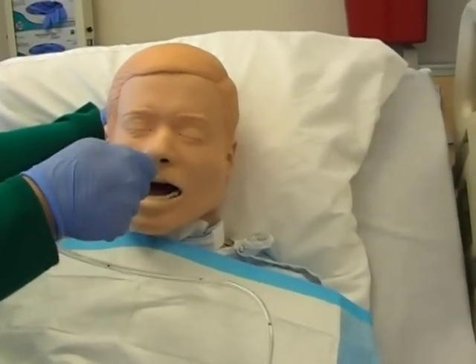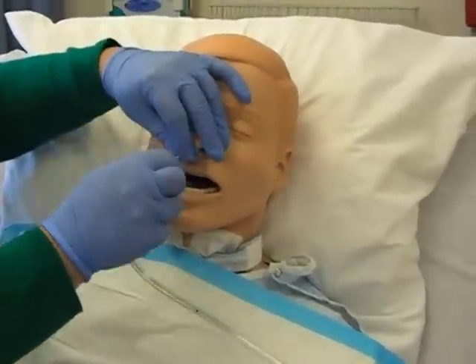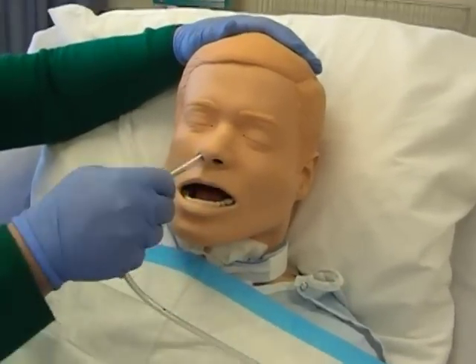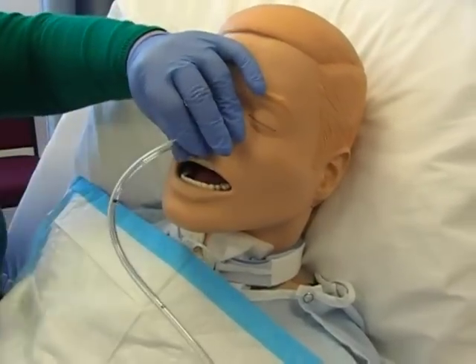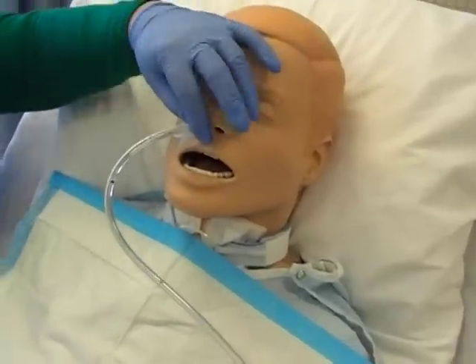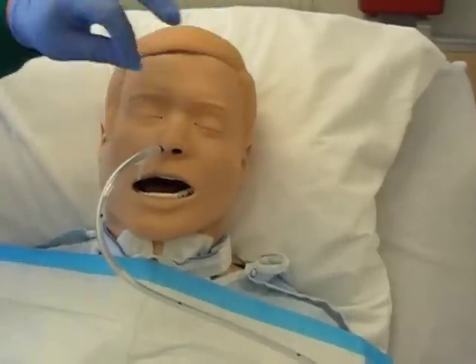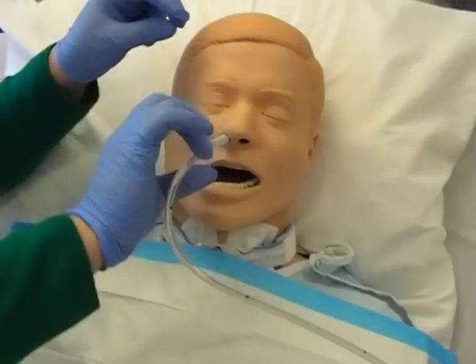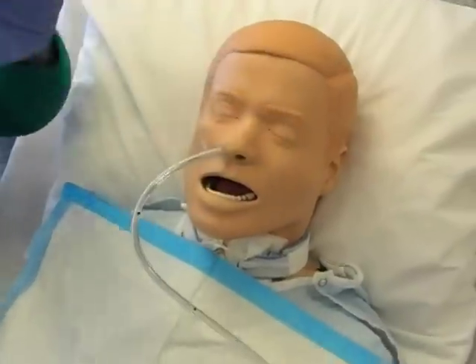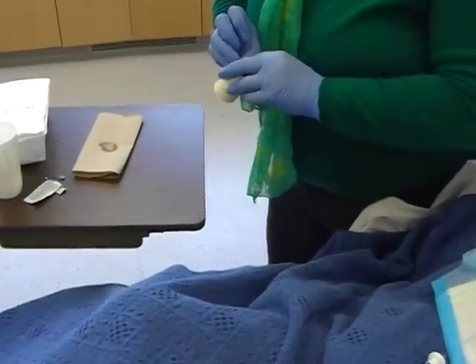Continue inserting, encouraging the patient to swallow repeatedly. Do not force or ram the tube in. Advance until you reach your tape mark — that is your target depth. Some facilities have a plastic NG holder that clasps the tube and adheres to the face. If that's not available, use tape to secure it.